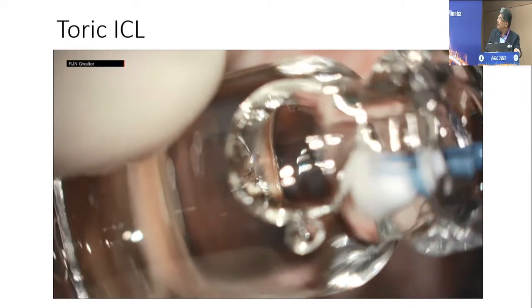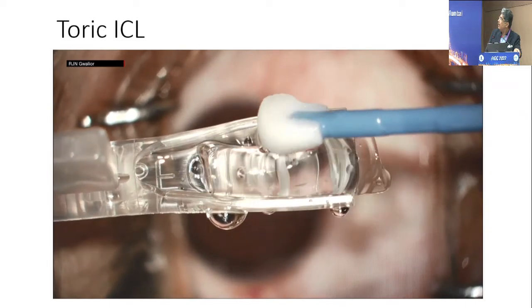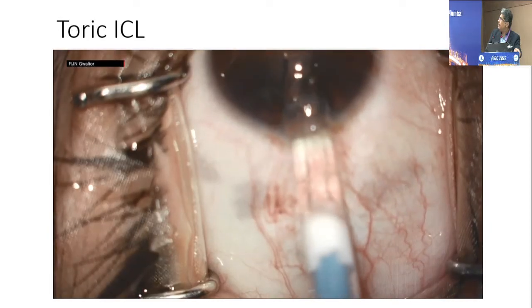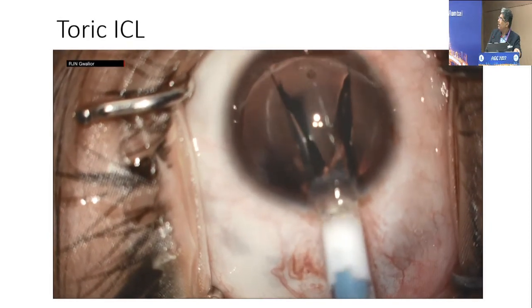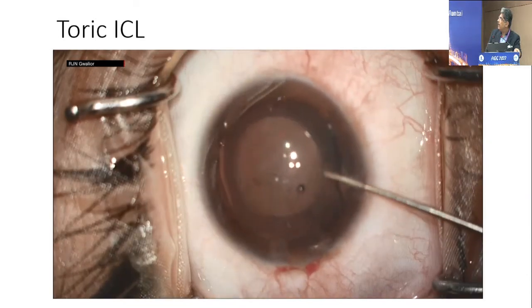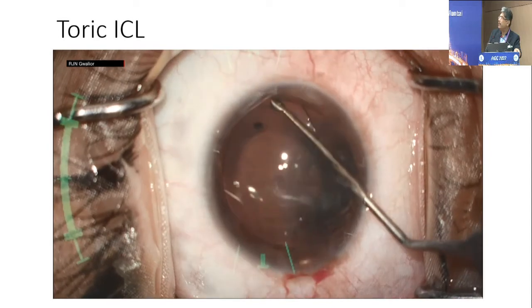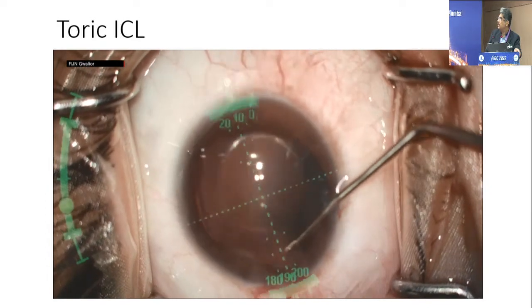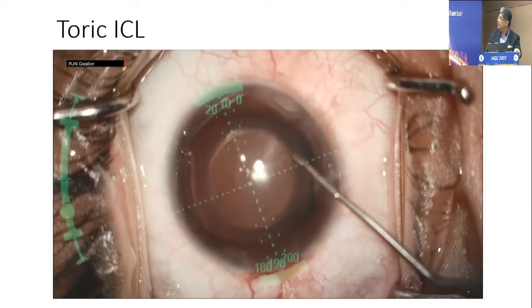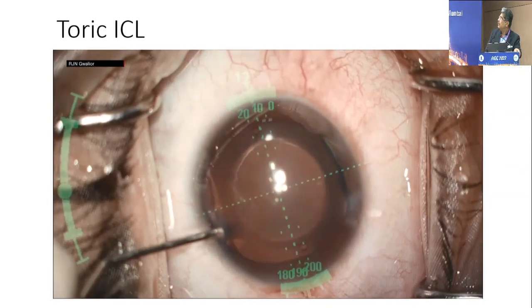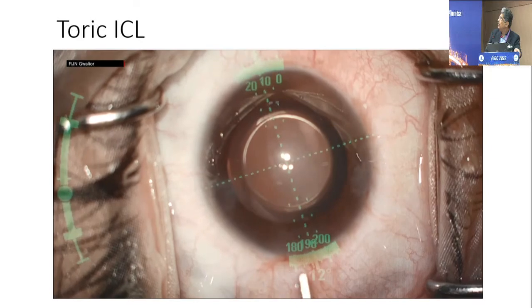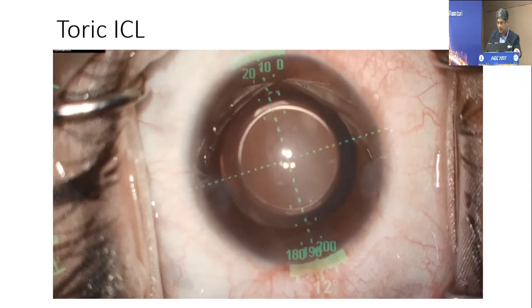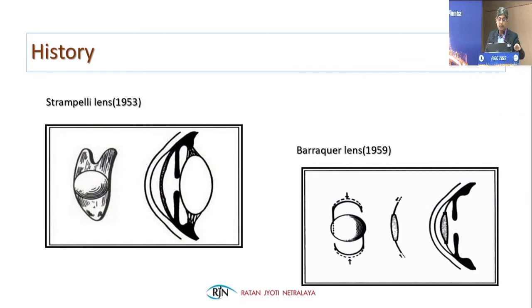This is the Visian ICL. It comes in a bottle in a BSS solution and with a soft-tip plunger you take it out from the bottle and place it in the cartridge — this is a front-loading system — and inject it into the eye. I use viscoelastic; some people don't, but the recommendation from the company, and my suggestion as well, is to use viscoelastic especially when starting out. This is a toric lens and you align it with the axis. It doesn't take much time — less than phakic IOL implantation — and the results are very gratifying.